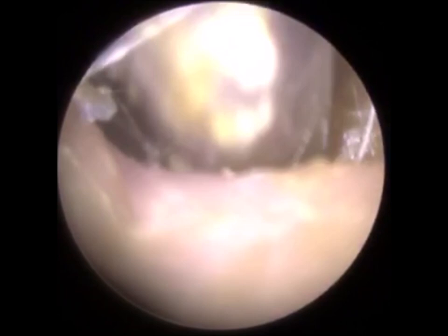This almost looks like a normal procedure at the moment, because it just looks like his normal ear canal, but as you can see on the left hand side, he's got a much widened ear canal, and you can see all that fluid that's collected behind that damp, moist skin because of the humidity. It's just seeping out there. So he didn't have an active ear infection of his eardrum. The eardrum itself was dry, and you'll see that in a few minutes. That wasn't infected. This moisture is just due to sweat and humidity and the dead skin that's becoming slightly infected itself. They were still pulling away there.